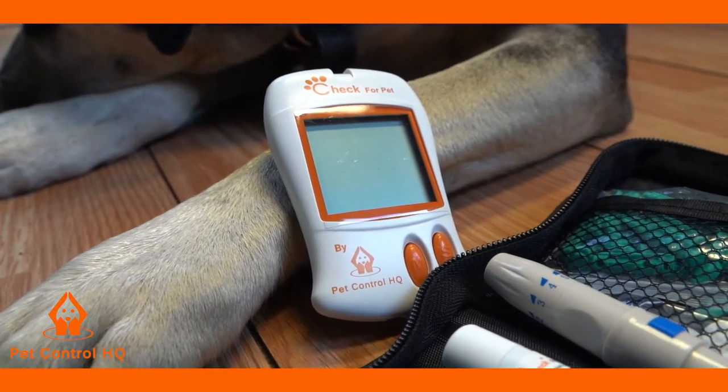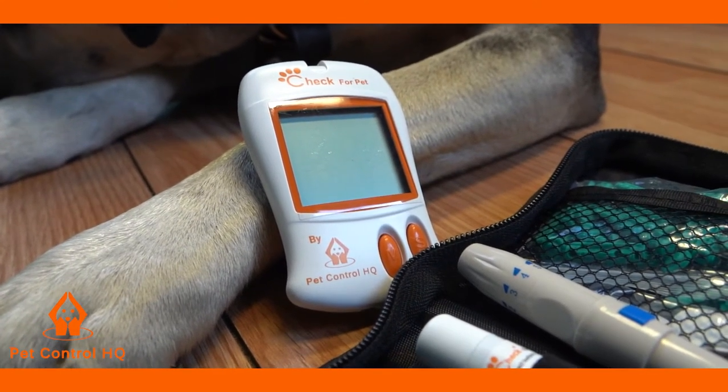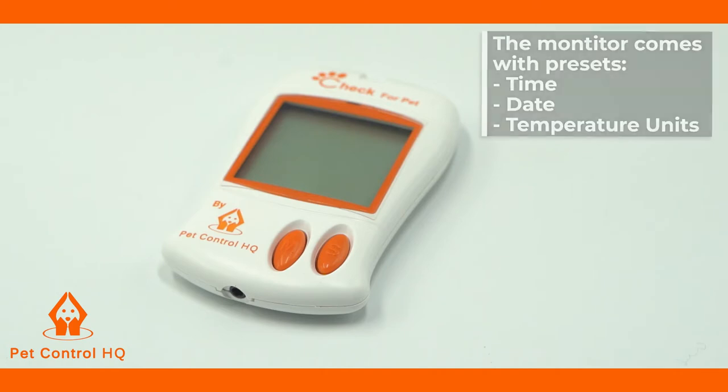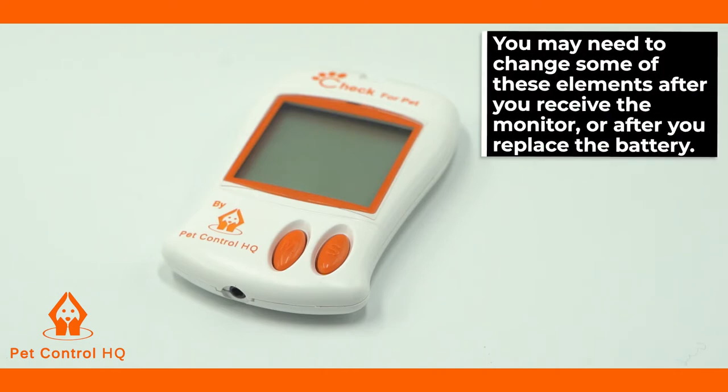This is a brief overview on how to change the settings on your PetControl HQ blood glucose monitor. The monitor comes with time, date, temperature, and measurement unit presets. However, you may want to change some of the metrics after you receive the monitor or after you replace the battery.